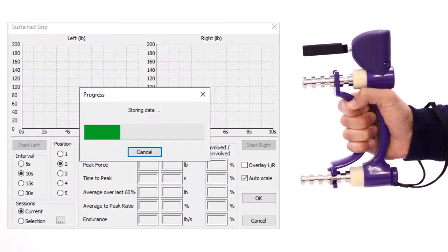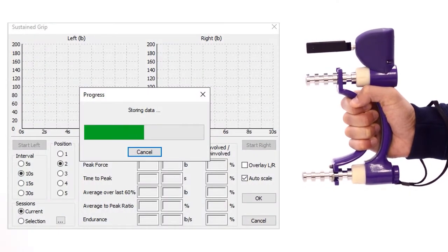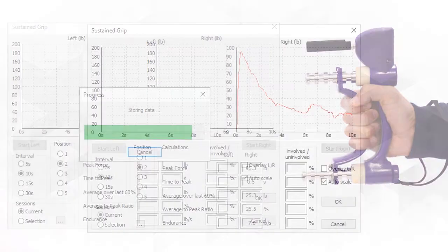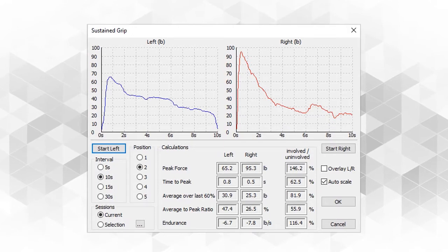Sustained grip test measures force over time in 5, 10, 15, and 30 second intervals and calculates peak force, time to peak, average, and fatigue rate.